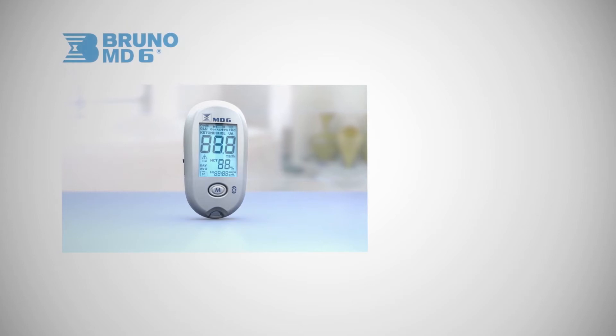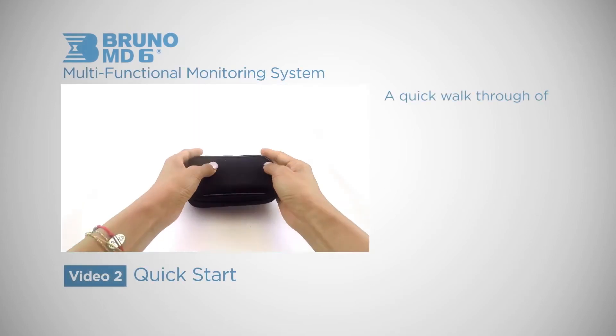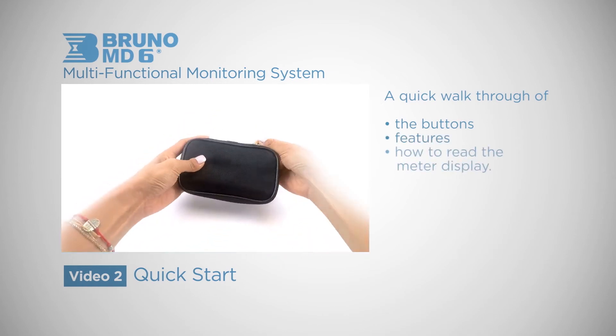In this quick start video for the Bruno MD6 Multifunctional Monitoring System, we're going to walk through the buttons, features, and how to read the meter display.